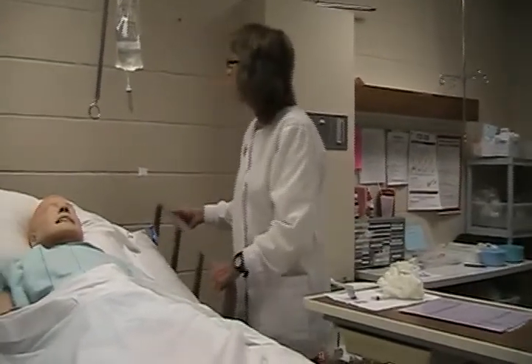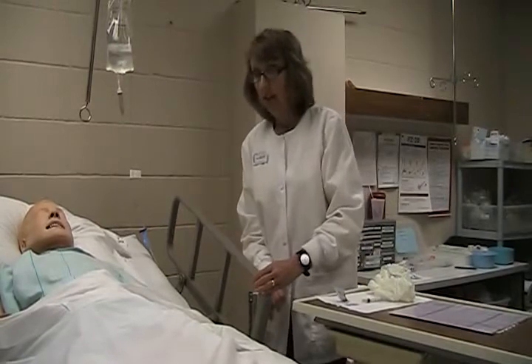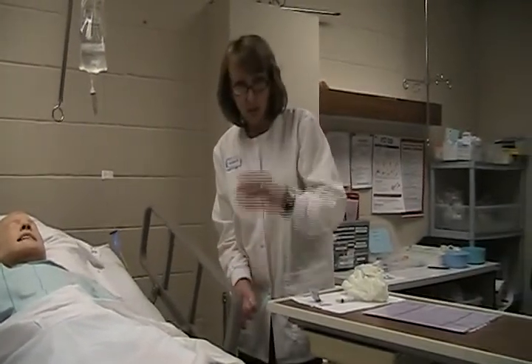Make sure my IV is still running at the correct rate, and let the patient know that I'll be back in 15 to 30 minutes to check on them for any adverse reactions to the medication. That concludes the demonstration of administering an IV push medication through a running line.